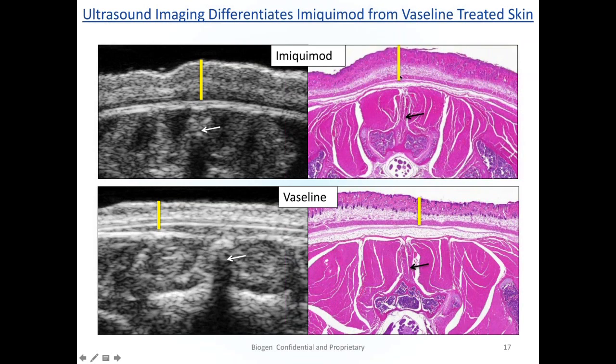In all cases, the pieces that I've barred on the histology image are our interpretation of what each layer means. But we can't prove exactly what we're looking at. That's our interpretation of what this region is in the histology.